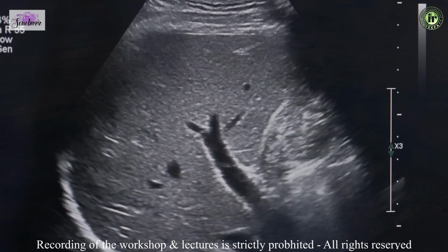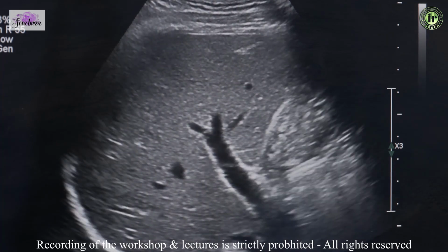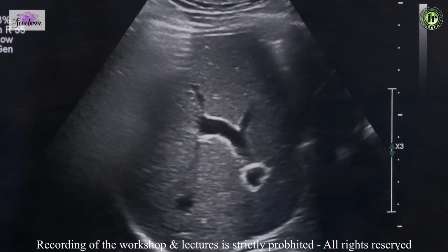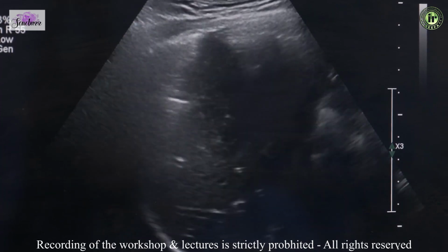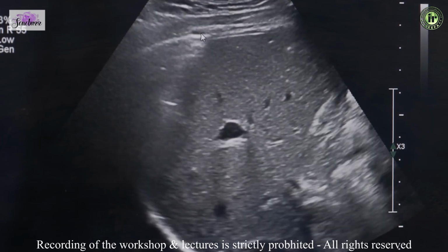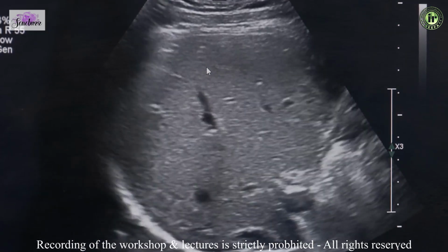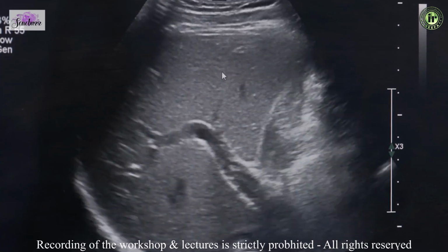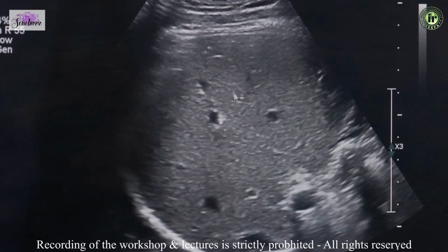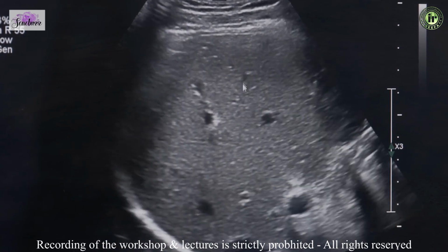Now coming to our B mode, like I mentioned, we need a very good B mode image, for which we are scanning within the intercostal space. We do not want this kind of an oblique image to pop up. We do not want these shadows to pop up. We do not want the diaphragm in our picture, or at least wherever we are taking the reading. So we want a very clear image, and ideally we want to avoid even the vessels and the biliary radicals.